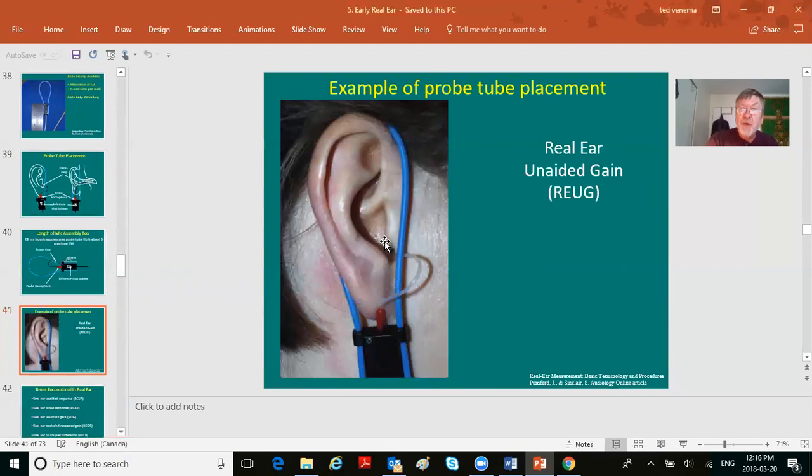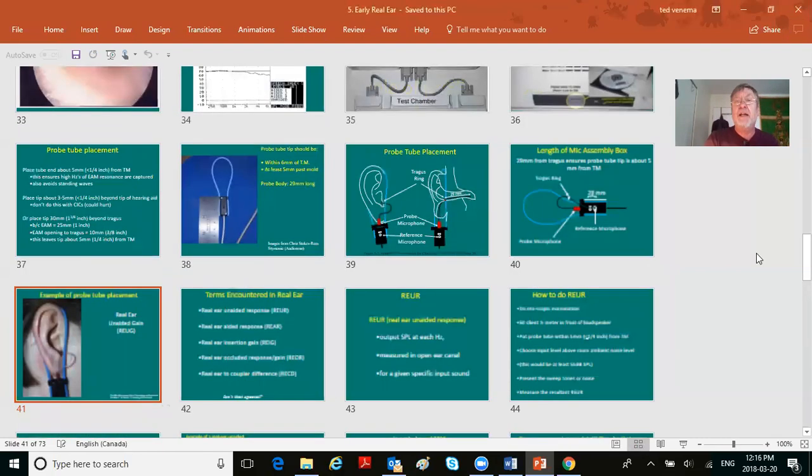Well, coming through that tube is going to affect the sound coming into the mic. You need to do calibration to get rid of the effects of that tube. You want the mic to be picking up the sound, you need a tube in order to do that, but you do calibration in order to remove the effects of the tube on that sound. Get it? Good. All right, now we'll go back.